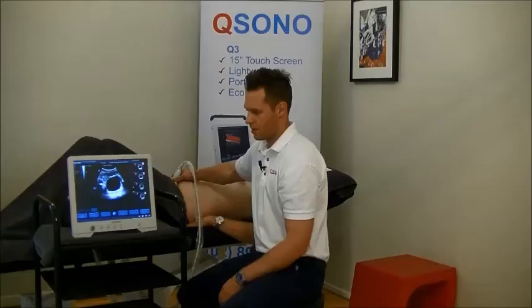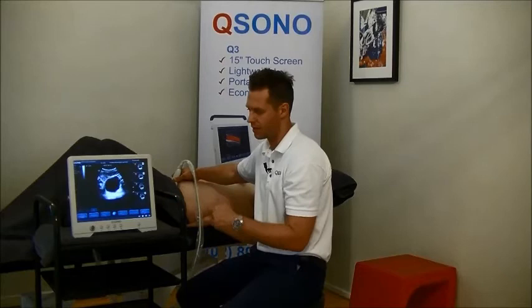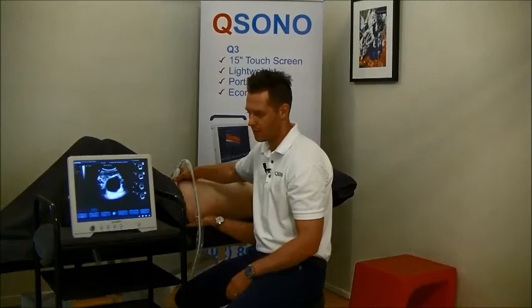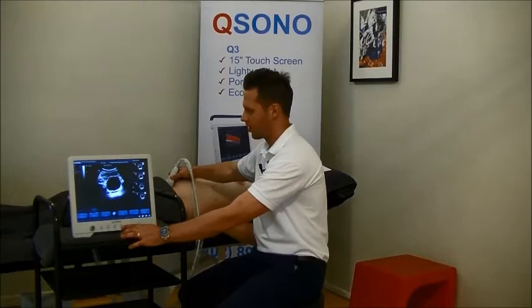So other things that we might be interested in having a look at with a pelvic floor view on the ultrasound is what happens when the patient does an active movement. Does the bladder base drop? Does it elevate? Are they able to maintain a pelvic floor contraction when they're moving their limbs? So could I just get you to straighten both legs out for me? Just let them drop out. Let's see what happens now when you do a straight leg raise to that bladder.